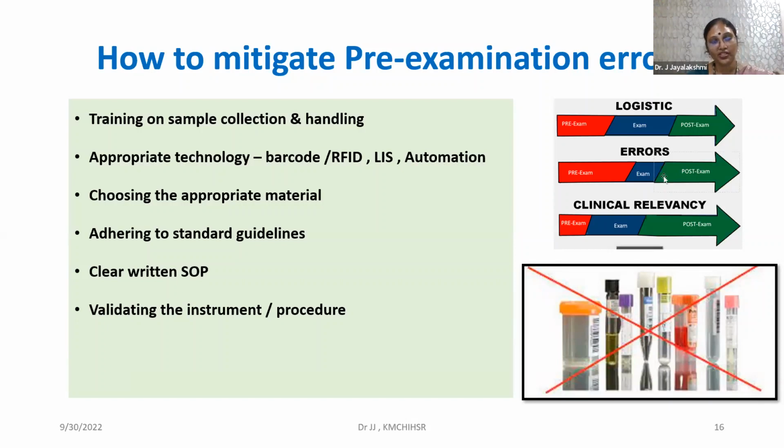It could be your centrifuge that you are using, or the instrument that you're using for collection of the sample, or the procedure in which you are doing is accepted and acceptable, right? Have a very strict sample rejection criteria. At the same time, you should also have clarity of thought on those very unique special samples which are very difficult to get again. So work out and find out whether it's the right sample that you have collected.